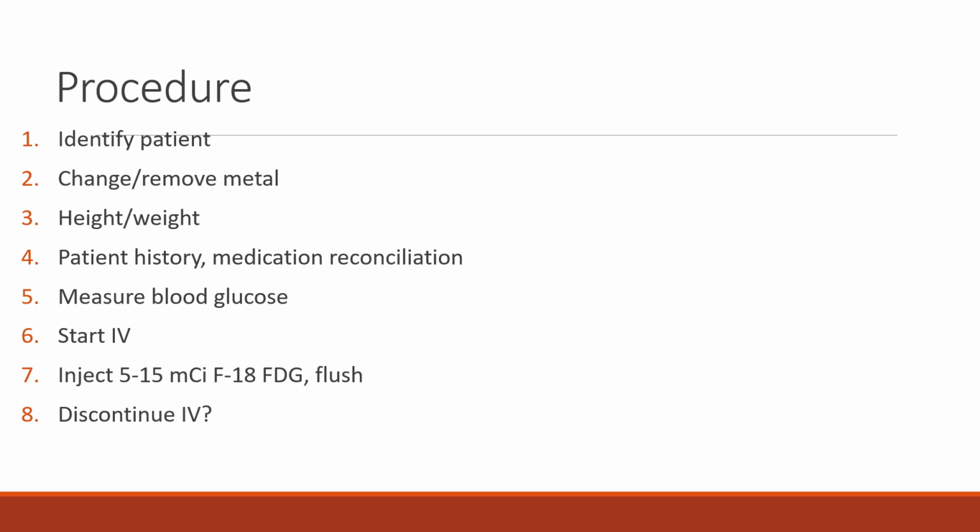There is a question on whether or not to discontinue the IV at that point. Sometimes people will leave the IV in if the patient is diabetic or if their blood sugar was high or low to start, just in case they need to give them something else. Of course, if you're doing diagnostic CT with it and you're using IV contrast, then you could leave the IV in. It also depends on if the patient is having other tests later, if they're following their PET scan with a CT that has contrast or with an MRI that has contrast, then that's something to consider as well.